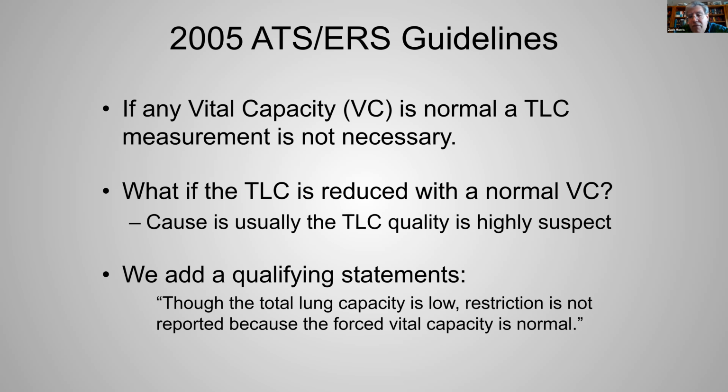They tell us that if you have any vital capacity that's normal, a TLC measurement is not necessary. In other words, if you have a normal vital capacity, slow vital, forced vital, or during pleth, you don't have restriction. A lot of centers that are really busy and doing a lot of tests like we are have criteria that if a complete PFT is ordered, and unless specified otherwise, if the vital capacity is normal, the tech does not have to proceed and perform lung volumes. They just put a note in our tech notes: not performed because restriction is not present.